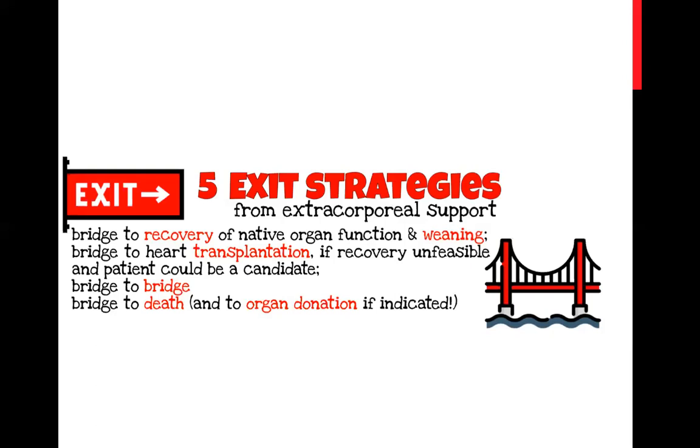I have one question regarding VA ECMO. Is it possible to use it intraoperatively in cardiac surgery instead of the bypass machine? The short answer is yes, but maybe Dr. Firas can elaborate more on that. He was asking about VA ECMO as a closed circuit, and whether we can use it during cardiac surgery.